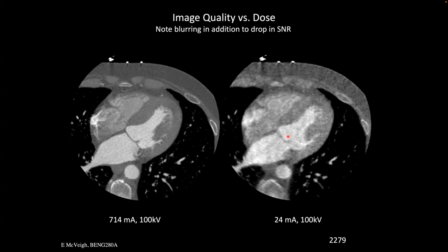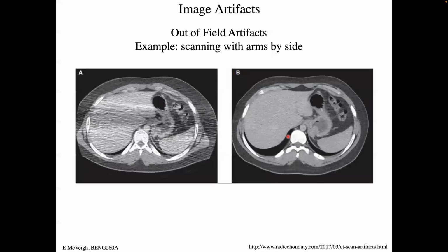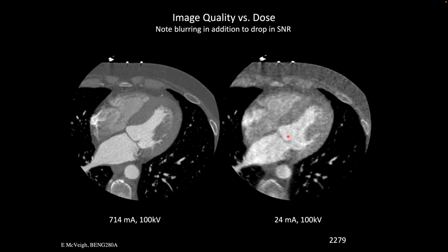What does your signal to noise do when you reduce the number of photons? Because there's a little demon in the back who keeps on messing with the data to keep the signal to noise about the same, if possible. However, the interesting thing here also, right, is that this is a huge reduction in X-ray dose.